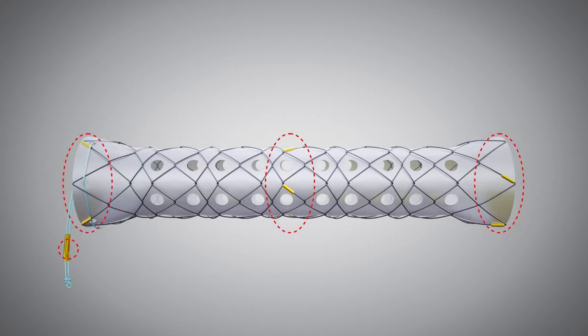There are 12 radiopaque markers on the stent body and one on the lasso for fluoroscopic guidance. A lasso on the proximal end is for repositioning and removal of the stent.